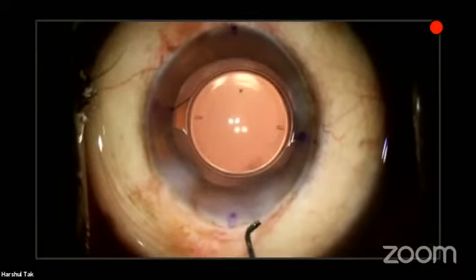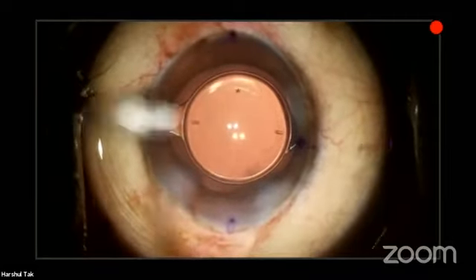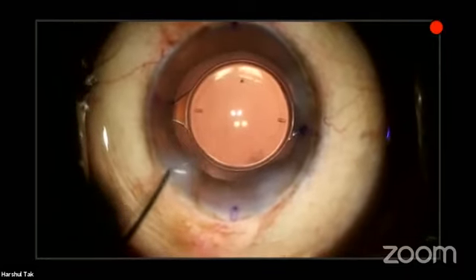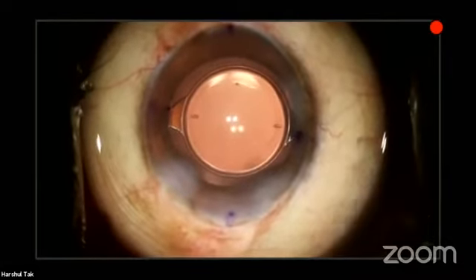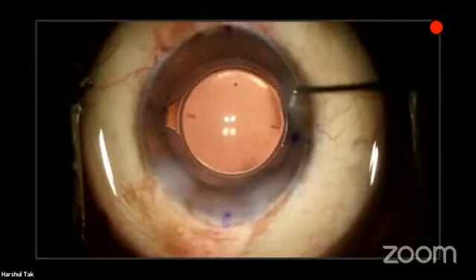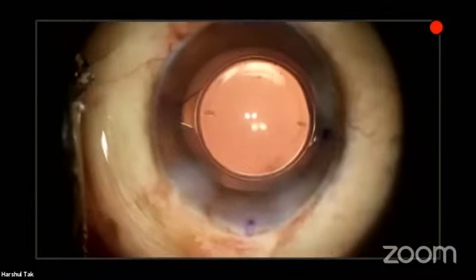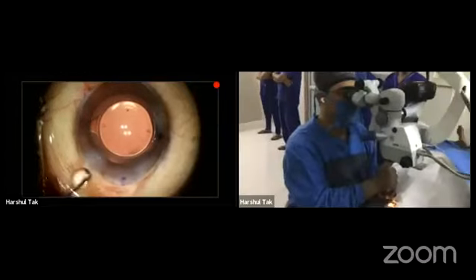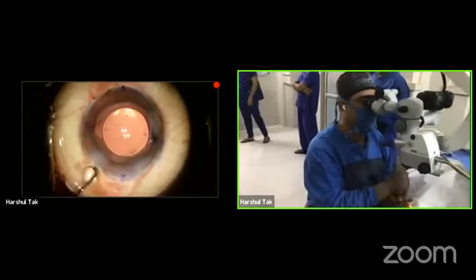Yes, Satanshi. Harshul, have you tried injecting the IOL without viscoelastic, under air, under the fluid? I hear you. Can you please come again? Yes, I can hear you now. Have you tried injecting the IOL without viscoelastic under the air or with the fluid? Yeah. In toric? No, that's what I did. I did hydro implantation only just now.